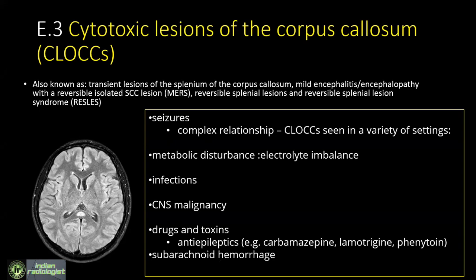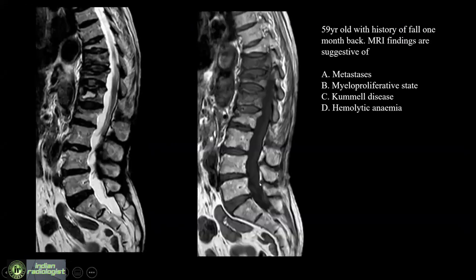Now let's move to the next question. There are sagittal T2 and T1-weighted images on your screen, and you have to identify what this condition is.